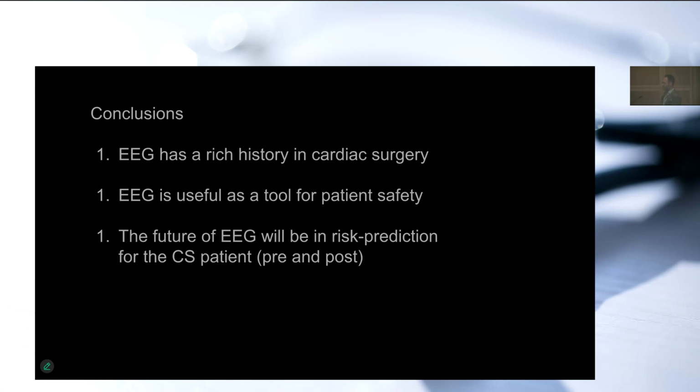The first question, for democratizing EEG, yeah, I suppose. First of all, we have better devices now because we have transitioned from index-based to spectral-based assessments of EEG for the most part. And I think that has done a lot to make the tool more reliable and to make people feel more willing and interested to learn how it all works and find these discrete event-related potentials that will predict intraoperative behaviors and prevent adverse events like awareness, but also burst suppression and cognitive adverse events after.